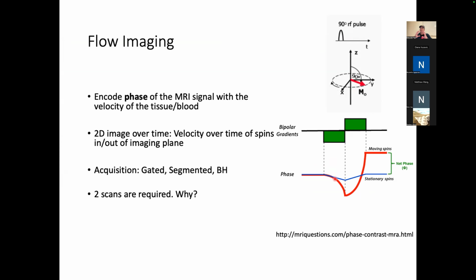However, as it moves along, it moves to lower and lower field values, so the phase accumulation gets slower and slower, or goes in the negative direction, and it peels off in a quadratic way. When you write down the equation for how this works with the velocity term in there, this phase goes down as a quadratic, right? So it's as t squared when this is a constant gradient.